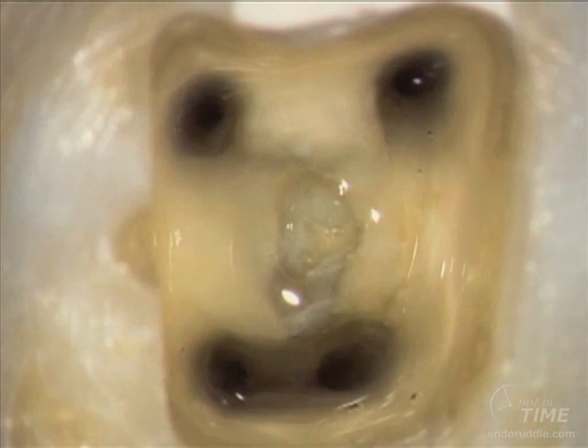Here are the shaped canals. And as an aside, this is the face of endodontics. When we have shaped canals and disinfection protocols accomplished, we're ready to commence with warm vertical.